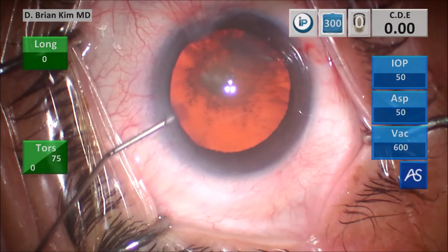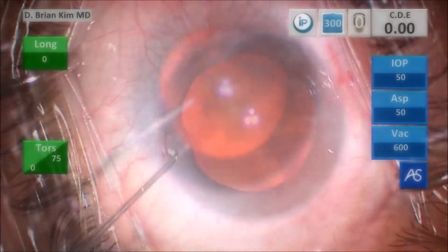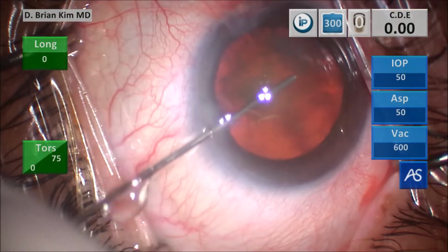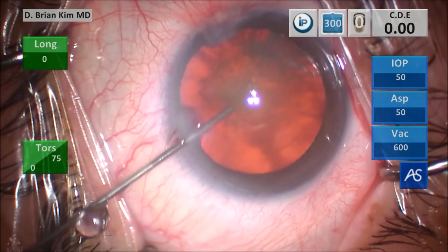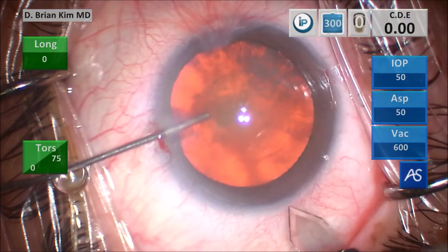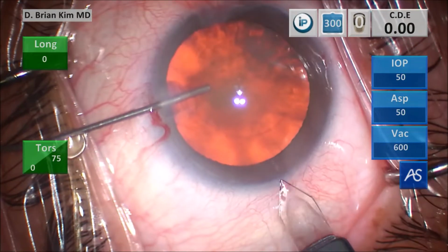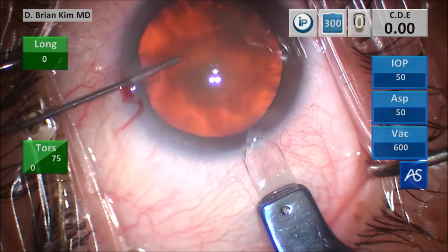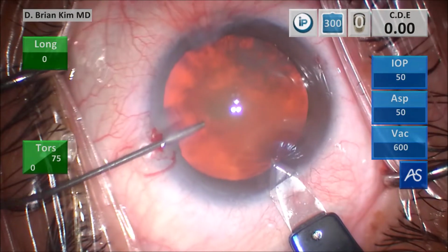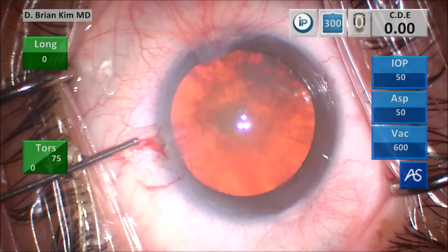This is intracameral lidocaine and then some intracameral epinephrine, and then some dispersive viscoelastic to coat the corneal endothelium and flatten the anterior capsule. Using the cannula to hold the eye steady, this is a triplanar corneal incision. I make a vertical groove, place the blade into the deep part of the groove, tunnel through the cornea, and then when I'm ready to enter, I turn the cannula towards me. The cannula gives me great control when I do that maneuver.